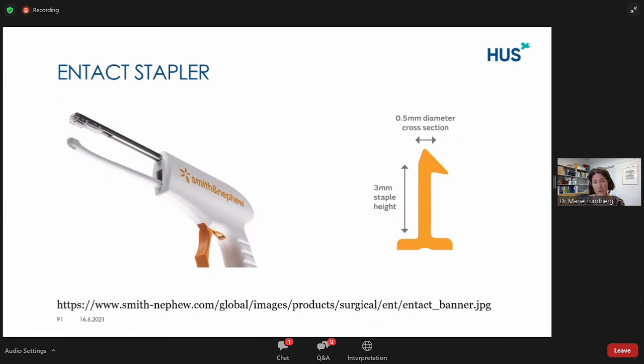For those who don't know the ENTact stapler, it's a device that contains 8 staples made of PLGA, which is the same as Vicryl. That is, they're bioresorbable, and the device is introduced into the nostrils on both sides of the cartilage after septoplasty, and then the mucosa is stapled to the cartilage. The staples are 3 millimeters high and 0.5 millimeters in diameter, so quite small.